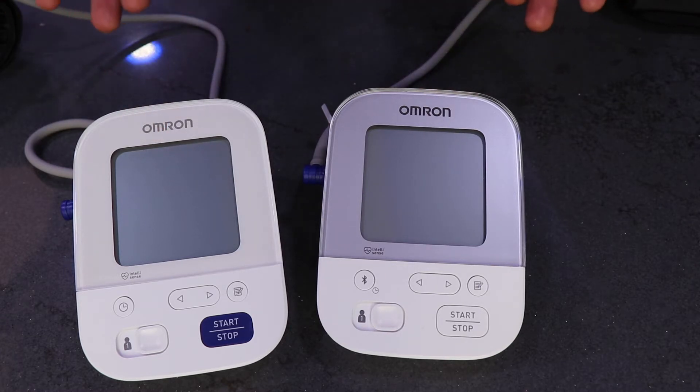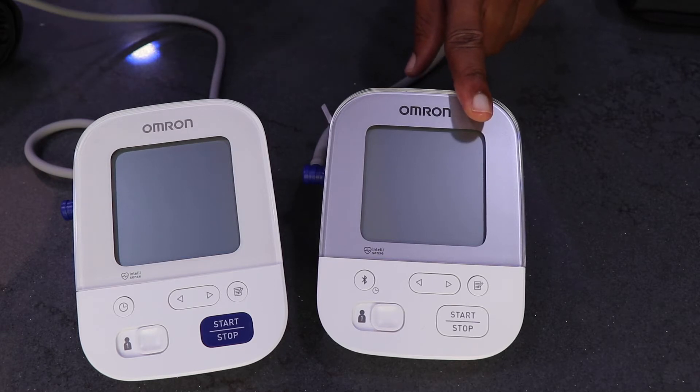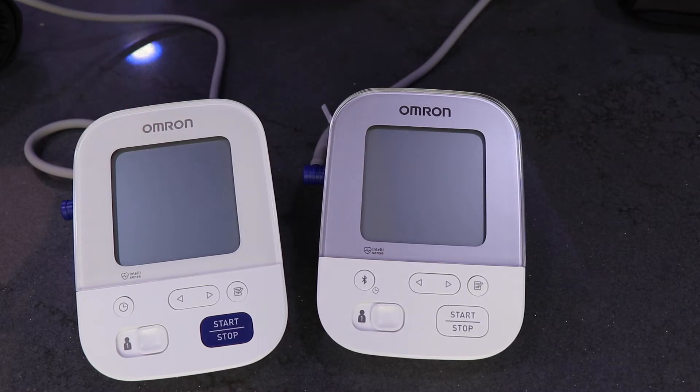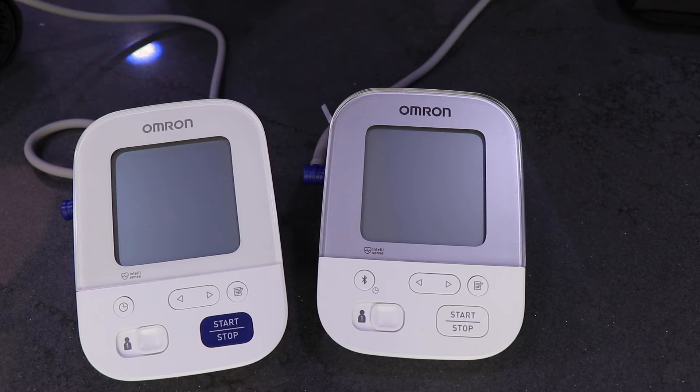The difference between both of them is that the X4 has Bluetooth connectivity, which means you can connect to an Omron app and upload your data. The X3 does not have connectivity at all, which means you need to find an app or write down the readings, although it does store your readings — but there's a limit, after which it starts to delete the oldest readings.